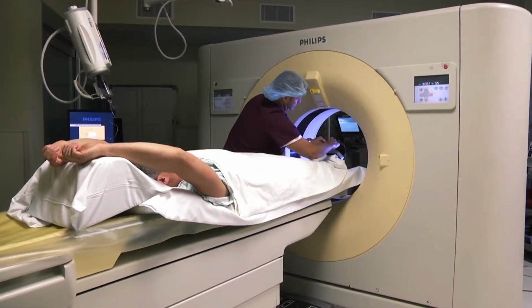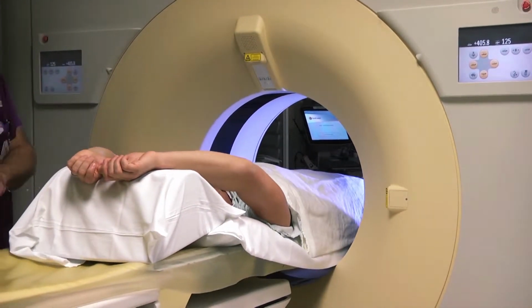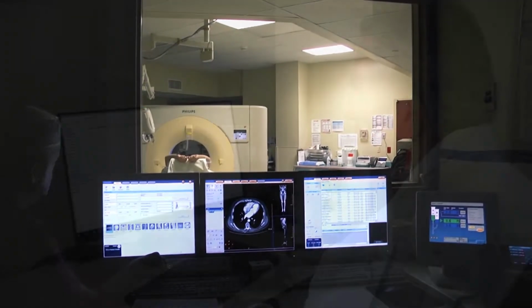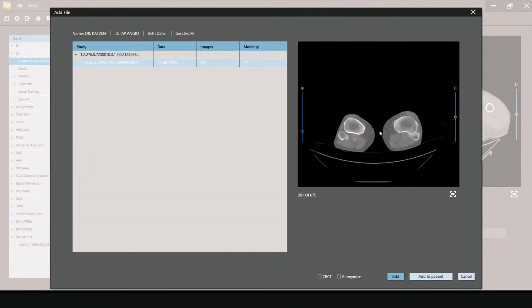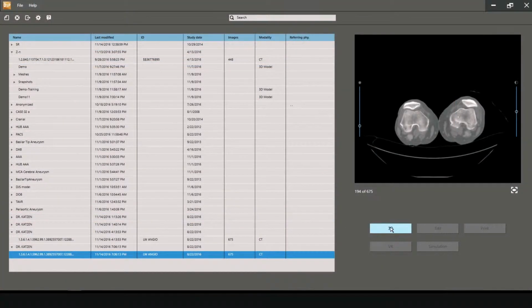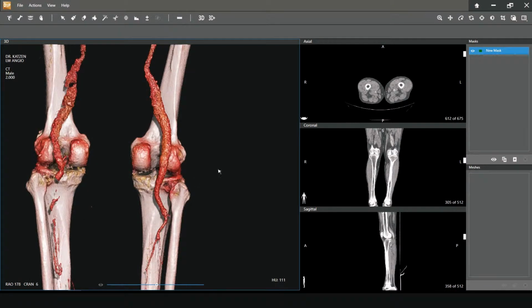So what we've been doing is taking CAT scans, which most people know what that is, and they're very frequently done now, and taking the unique data that comes from a CAT scan, which is very detailed. It's a group of X-ray slices that the average person couldn't make sense out of. And taking all that information that we get, put it all together with computers and generate essentially a model that anybody can understand. Patient, physician, and it can be made in very detailed referencing, which is basically the patient-specific anatomy. It's not like a make-believe type of model.